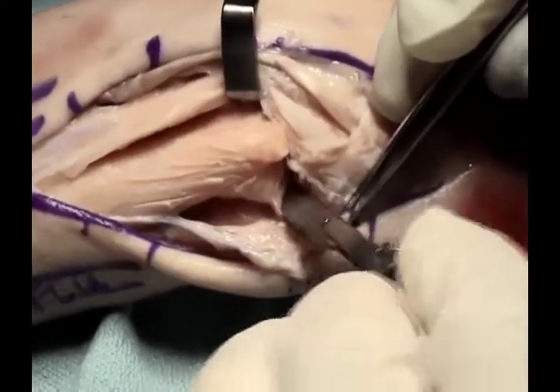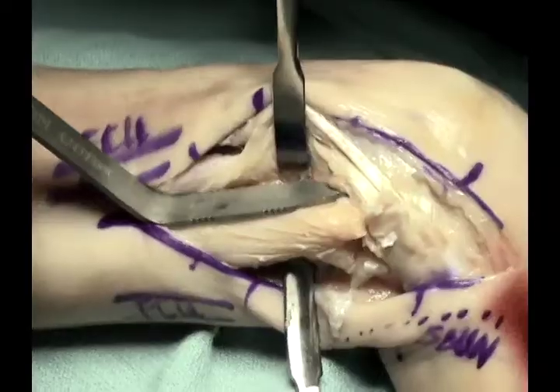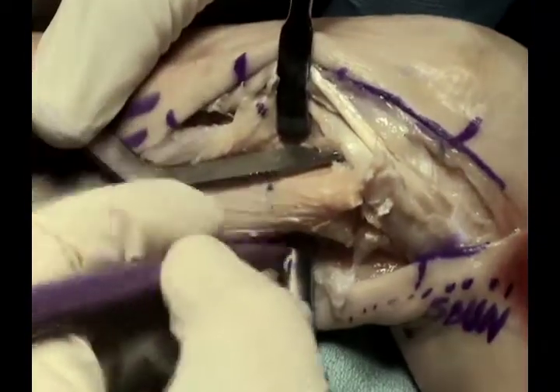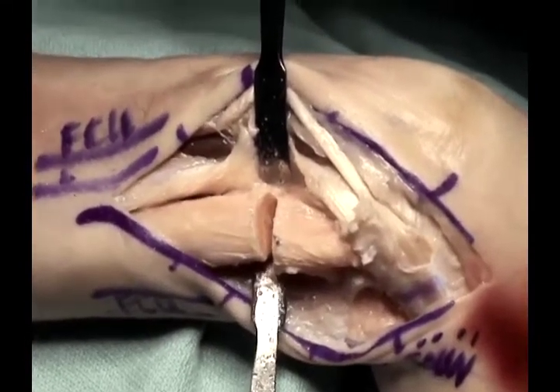The soft tissue attachments of the triangular fibrocartilage are released as well. Once the TFCC and other soft tissues are detached, the length for the arthroplasty and the osteotomy can then be marked out on the ulna, and the osteotomy completed with an oscillating saw using retractors to protect the deep structures.